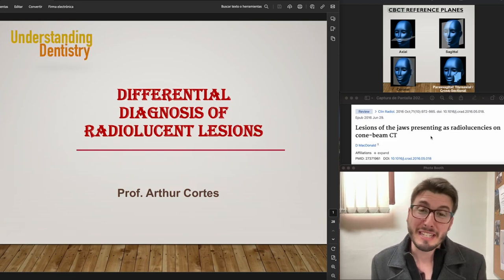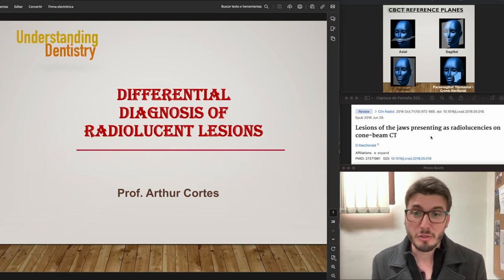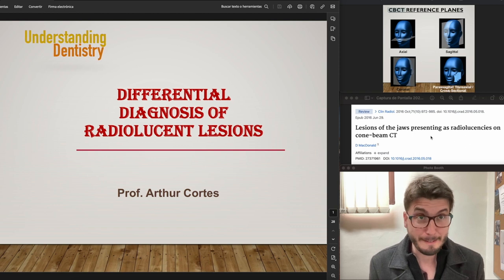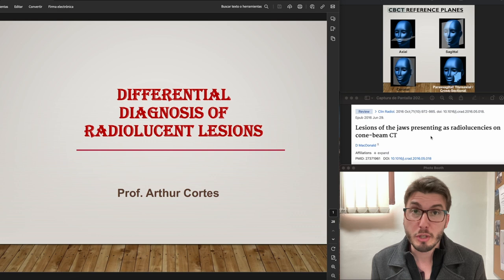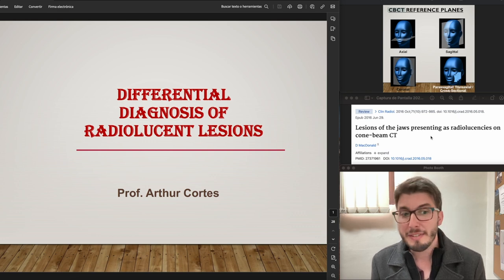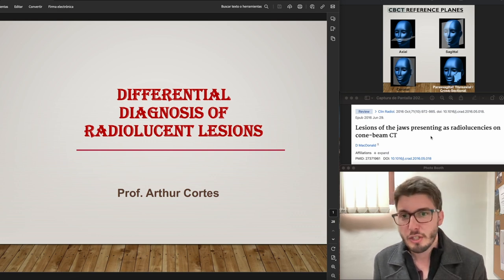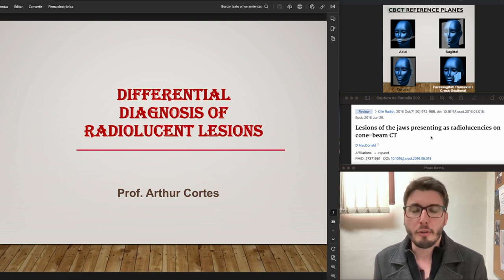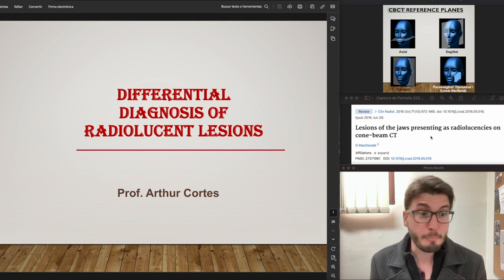Hello, and welcome to this lecture about differential diagnosis of radiolucent lesions using CBCT. It's very important to know how to work with multiplanar reconstructions and even 3D reconstructed models, taking advantage of all these images to define our differential diagnosis list properly.